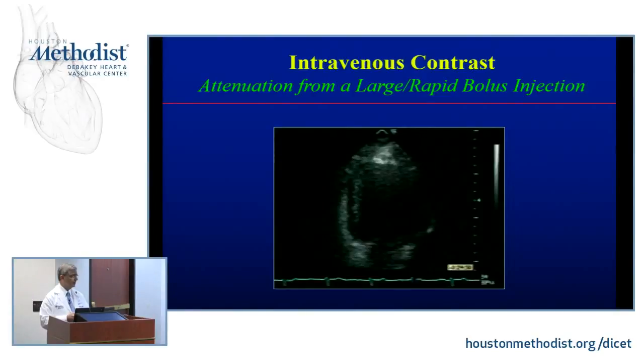Yes, you do see this phenomenon. You see it every day. And so if I'm injecting too much contrast, nowadays I think most laboratories dilute it, although if you look at the package insert, it doesn't tell you that you need to dilute it. Most people do dilute it. It's not going to affect the efficacy of the contrast. Part on the right side first and then on the left side, and gives you this attenuation.